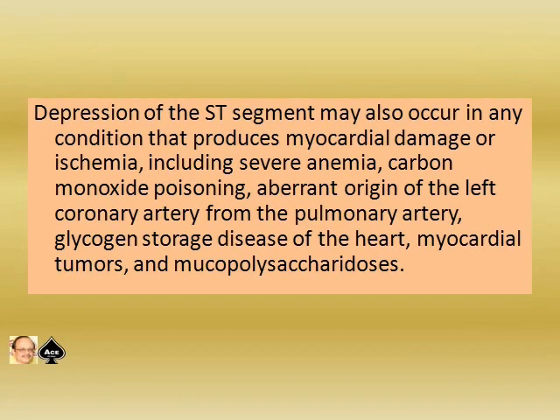Depression of the ST segment may also occur in any condition that produces myocardial damage or ischemia, including severe anemia, carbon monoxide poisoning, aberrant origin of the left coronary artery from the pulmonary artery, glycogen storage disease of the heart, myocardial tumors, and mucopolysaccharidosis.